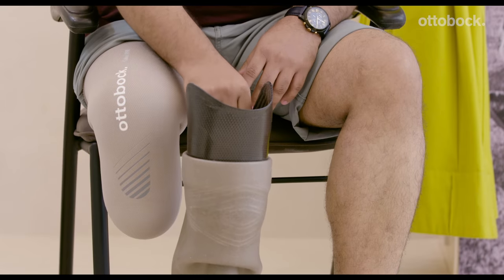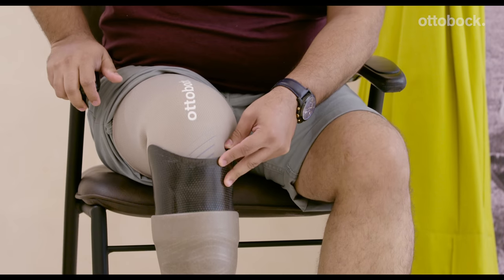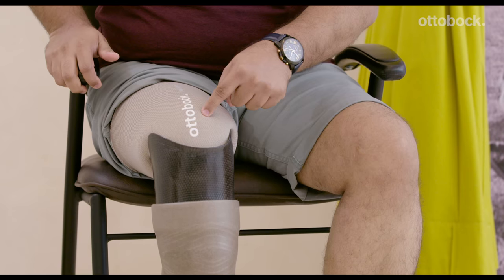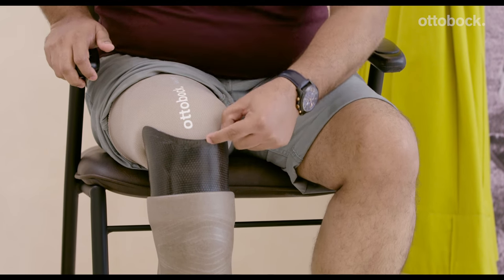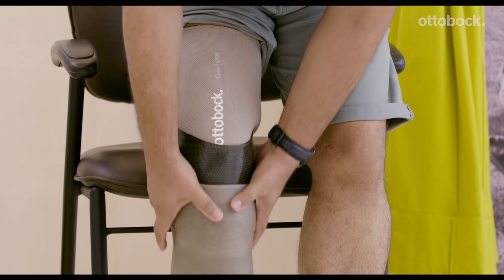To wear your prosthesis, you will have to flex your knee at a 45 degree angle and gently insert it in your socket. Once your residual limb with the liner is inside your socket, you can gently stand and then proceed to pull the sleeve.